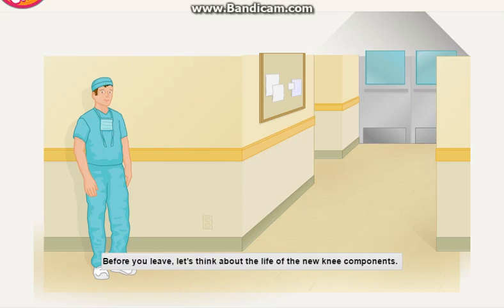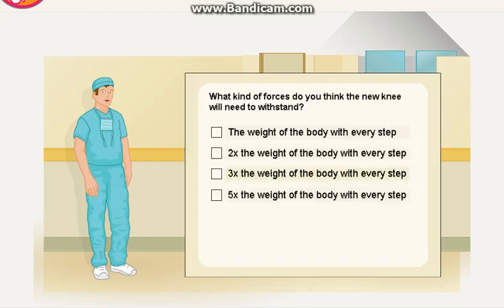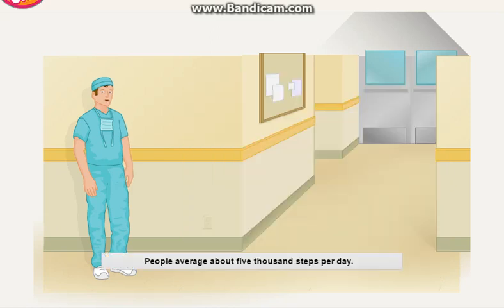Before you leave, let's think about the life of the new knee components. What kind of forces do you think the new knee will need to withstand? Nice job. People average about 5,000 steps per day. Our patient's new prosthetics will withstand a great deal of force for 36 million steps or more. I'm off to check on another patient while the OR team prepares the room for the next surgery.